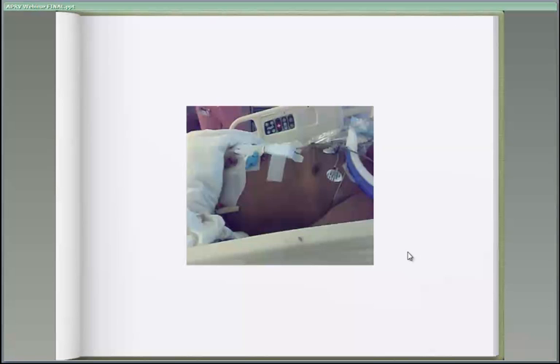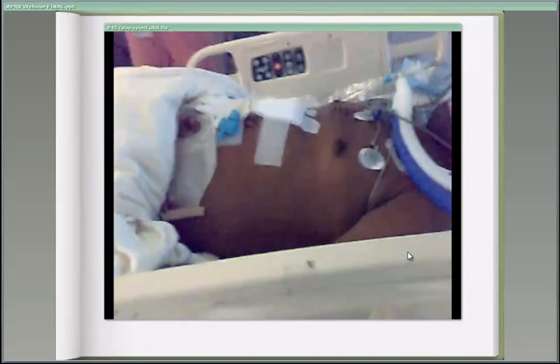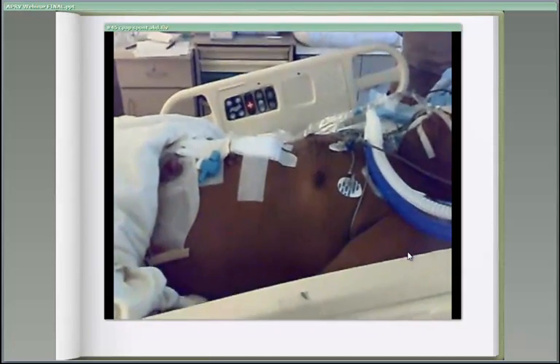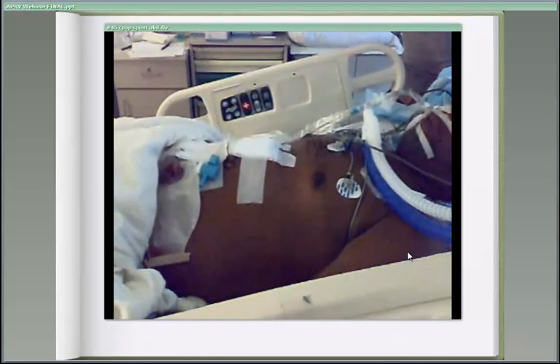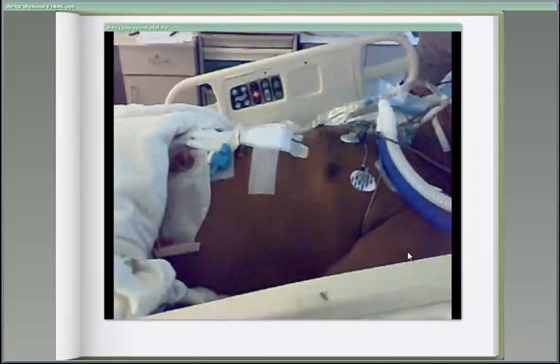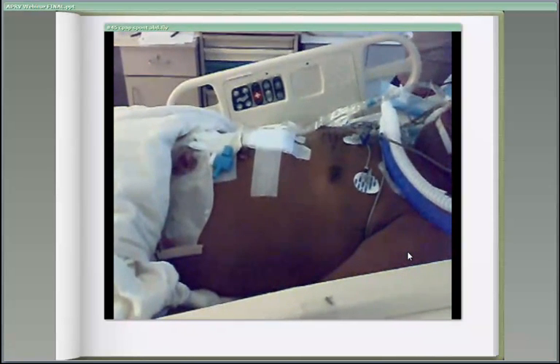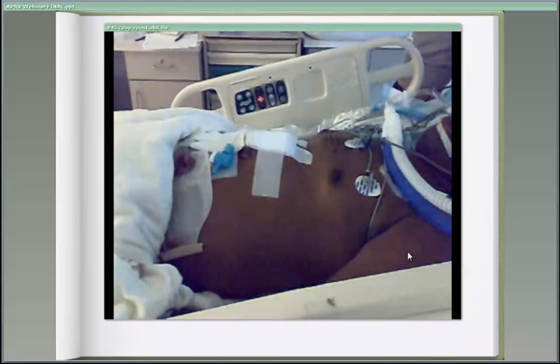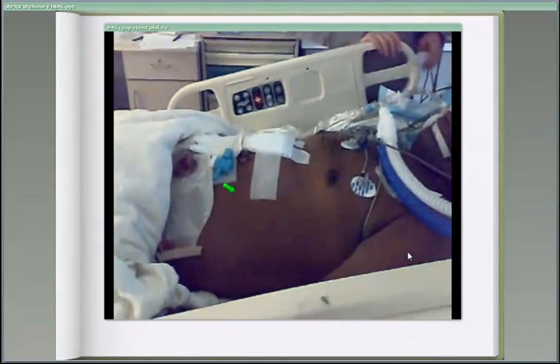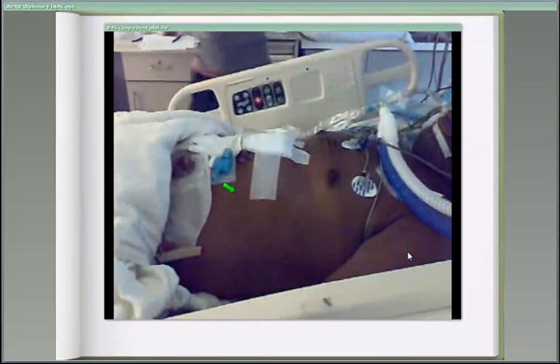Now here's a patient on CPAP, and one of the things that's clear about CPAP breathing is that as your lung volume goes up, the effort your inspiratory muscles put out diminishes. In fact, this is one of the reasons why in the early 80s, CPAP was used to unload the inspiratory muscle loading that occurs in COPD, because it generally recruits your expiratory muscles, and it keeps your inspiratory muscles very, very quiet. In fact, this is typical of CPAP breathing and APRV breathing, where what you see is really the abdomen moving. You see very little upper chest movement, because there's no need for inspiratory muscles, and the diaphragm just simply moves back and forth without a lot of tremendous transpulmonary forces.